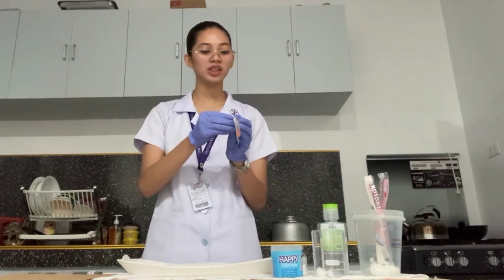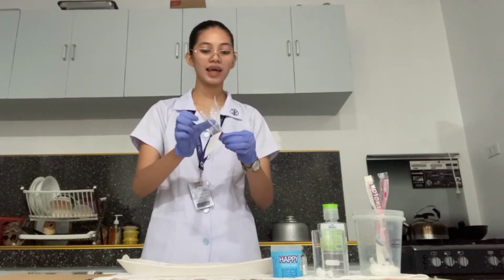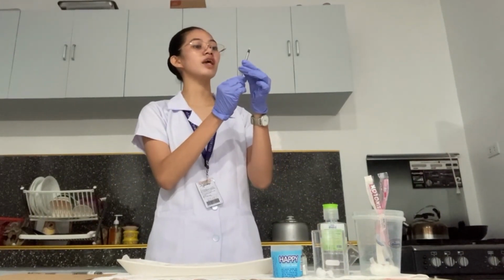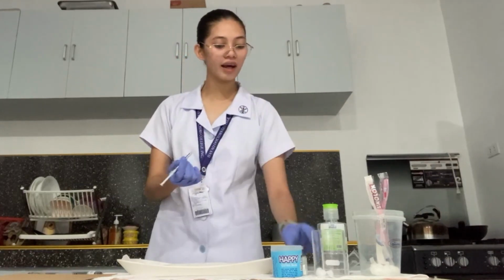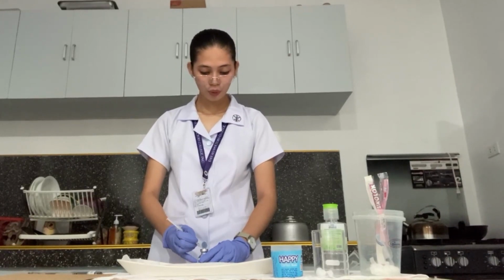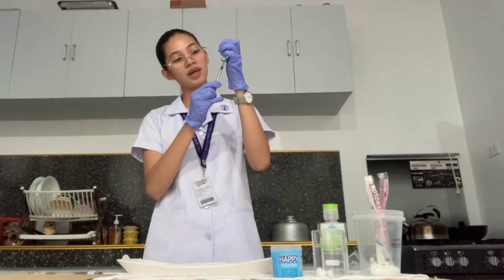We're going to grab our syringe, open the syringe, only touching the barrel and the plunger, uncap the needle. We're going to withdraw the same amount of air as the physician's requested medication. And then we're going to grab our vial, position our needle to a 45-degree angle, and then poke to the rubber, and then depress the air to the vial, invert the vial, and then withdraw the medication.